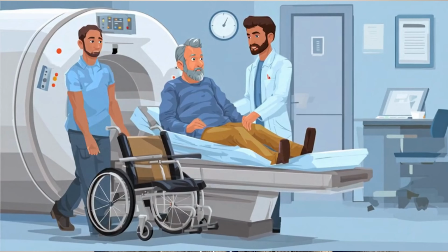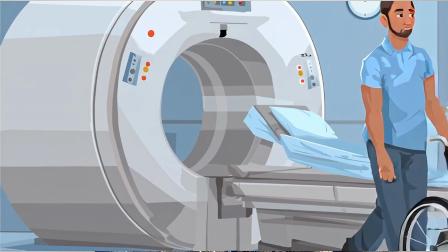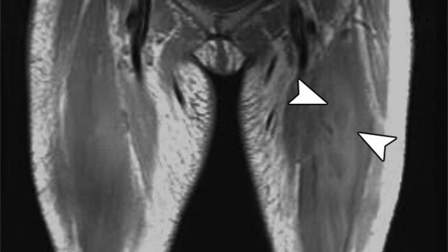Okay, then one more thing is even in your inflammatory myositis for example, we also use MRI here, because MRI can also pick up active inflammation in the muscles. So that will help us to guide a biopsy of the active muscle, which helps us in the diagnosis of inflammatory myositis.